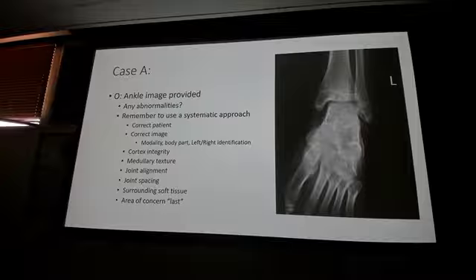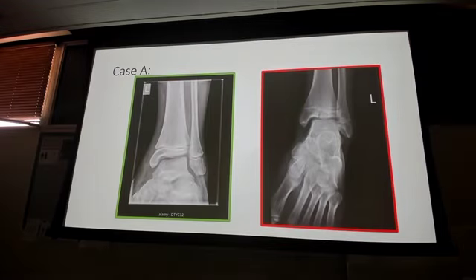Some of you are already there on your slides, so I'll be nice and go to this one for those of you that are using the screen. I'll even give you a normal next to the abnormal. It will not be like that on the test. Sorry. But you're still in the learning stage right now, so I'll give it to you.